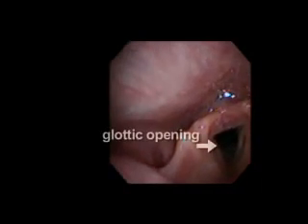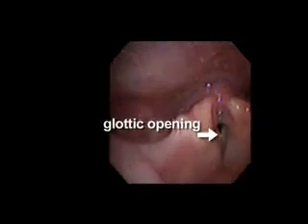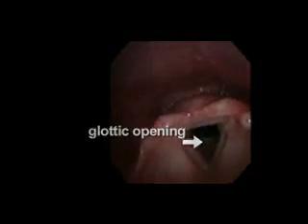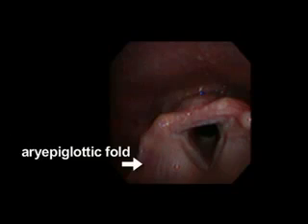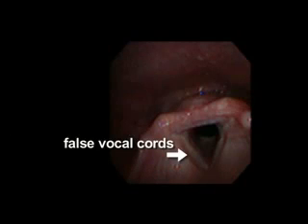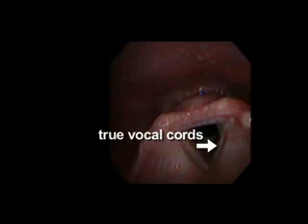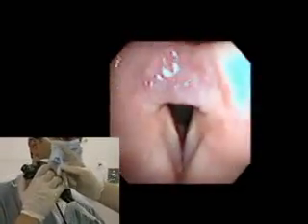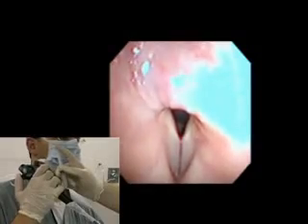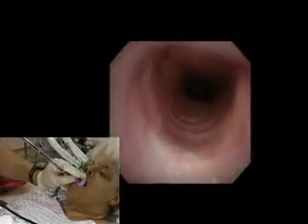Proceed carefully until the glottic opening is visualized. Identify the corniculate and cuneiform tubercles, aryepiglottic fold, false vocal cords, and true vocal cords. Cover the suction source. Spray 2 milliliters of 2% lidocaine via the bronchoscope through the vocal cords to block the recurrent laryngeal nerve. Wait approximately 30 seconds and advance the fiber optic scope and endotracheal tube through the vocal cords.